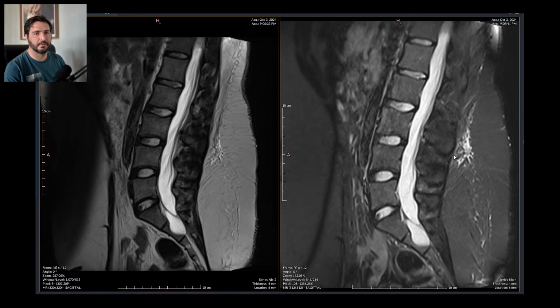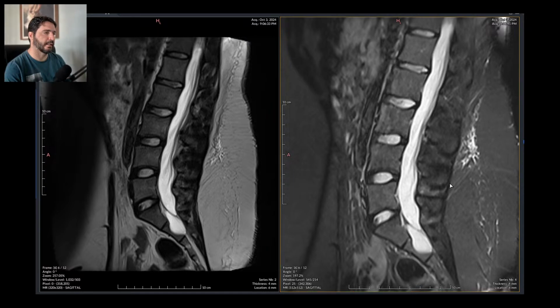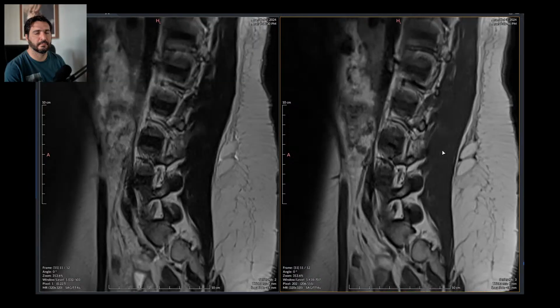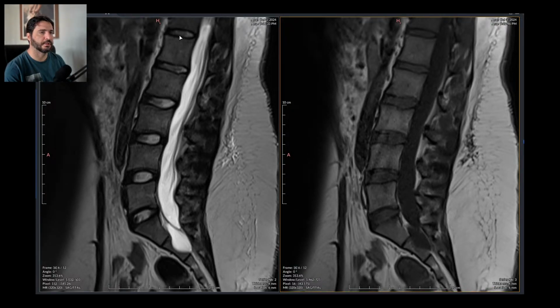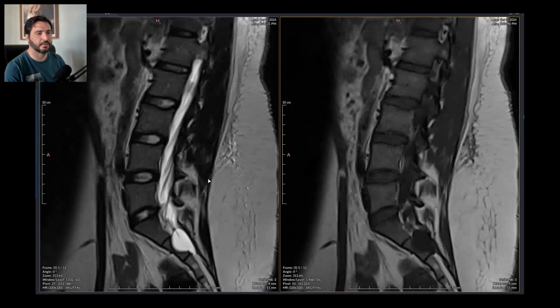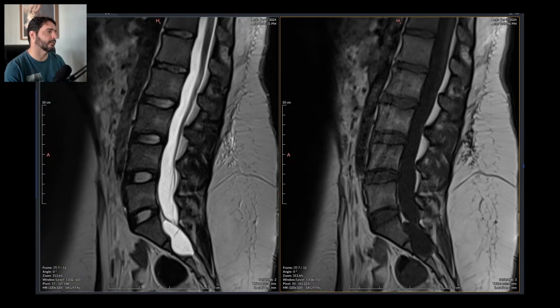So this is a T2 without fat saturation. This is a T2 with fat saturation right there. It's in STIR, steer sequence. And this is a T1 right there. So obese. Her lumbar spine seems quite normal. There are no signs of dehydration of the discs, just a little bit right here, maybe something right here and a bit here, but it's very common at her age, so nothing major. I know you guys have seen this already. These are a few meningeal cysts, nothing major.